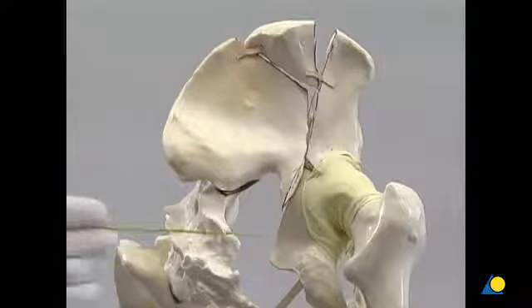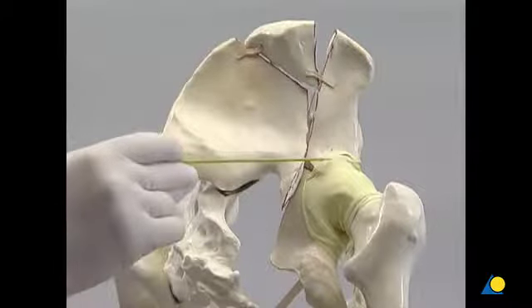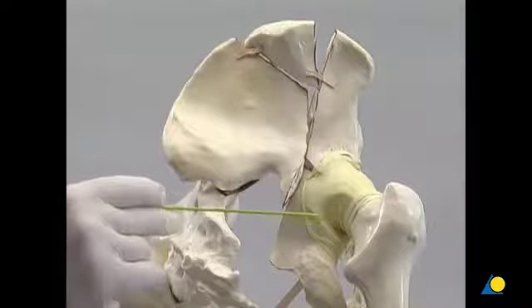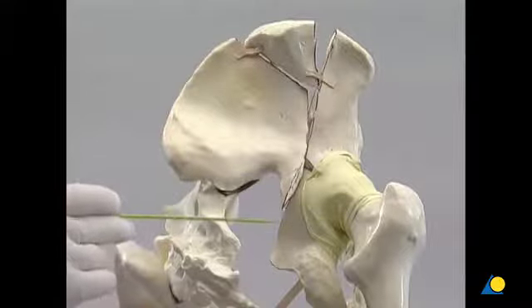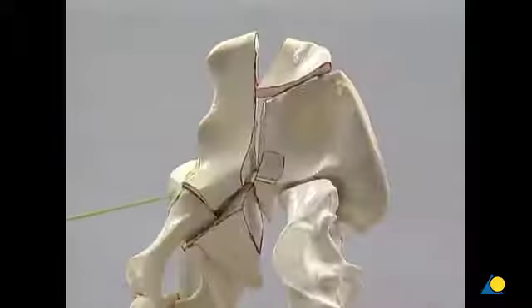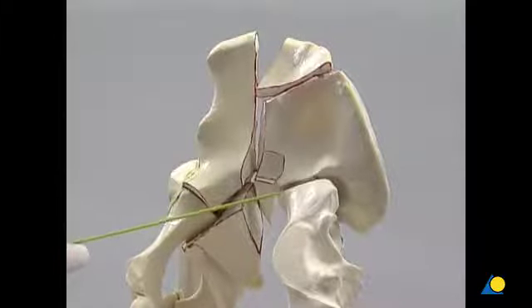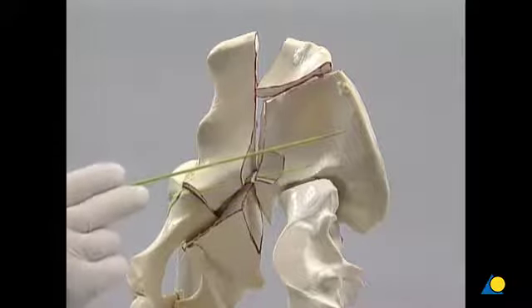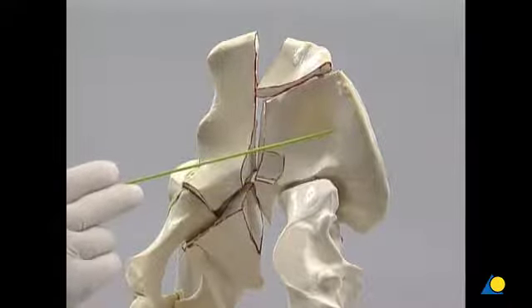The hip capsule usually remains intact. It is attached to the anterior and posterior columns, allowing indirect reduction of the posterior column through an anterior approach when ligamentotaxis is applied. When viewed from the internal aspect, the sacroiliac joint and the iliac wing fragment that remains attached to the sacrum can be seen.